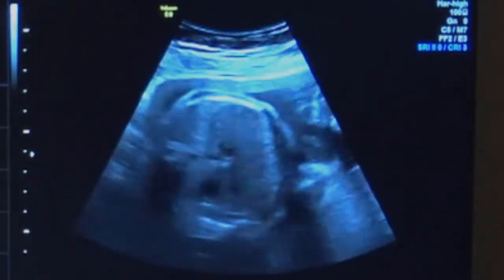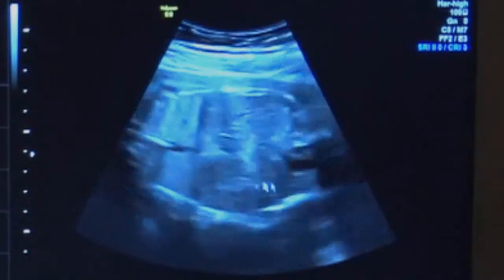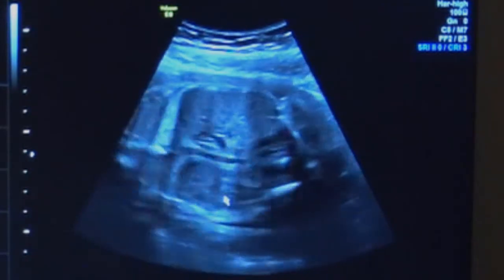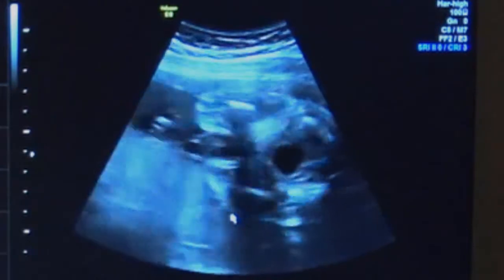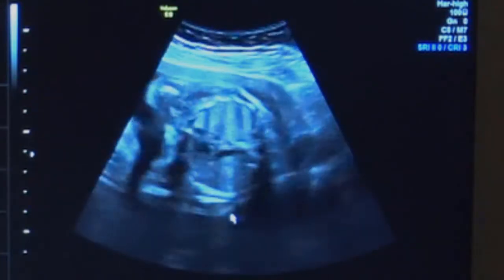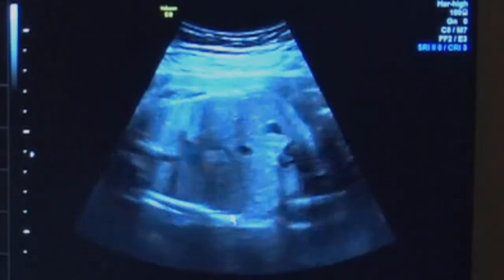Beautiful heart beating away, coming down. You can just do all your normal checks. You've got stomach, fluid-filled stomach, fluid-filled bladder. We also just have a quick look through the kidneys, both sides of course. Do diaphragm. If you can see the skin line, we try and do that at some stage as well, looking for sacrococcygeal teratomas and things that might pop up in the third trimester.